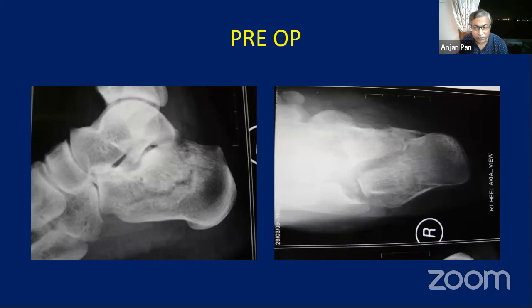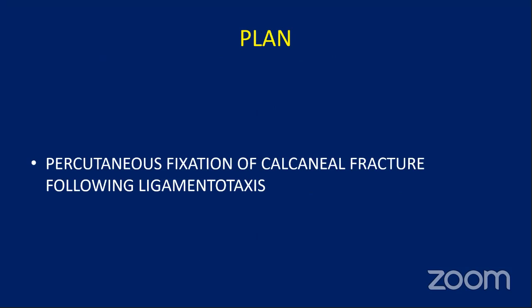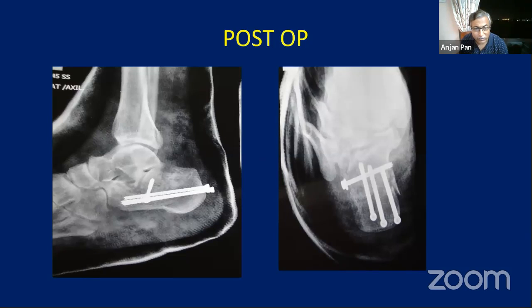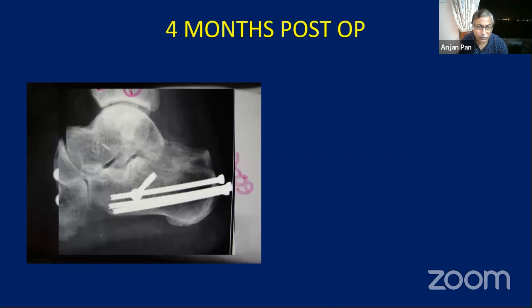This is the pre-op picture. The plan is percutaneous fixation of calcaneal fracture following ligamentotaxis. So this is the post-op picture. This is after 6 weeks. This is after 4 months.